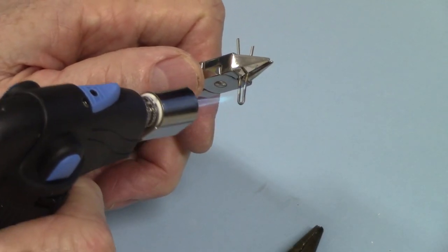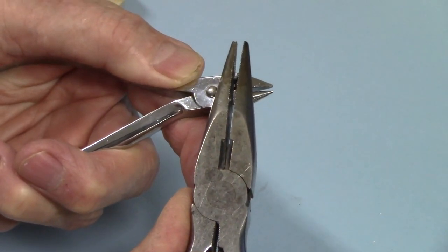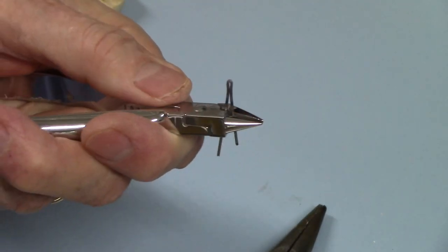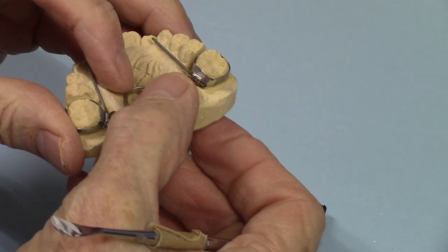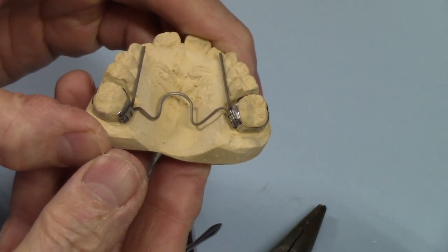Now I'm crimping it — there you go. That will slide into the lingual sheath and then I can adapt the wire so that it becomes this expander. There you have it.